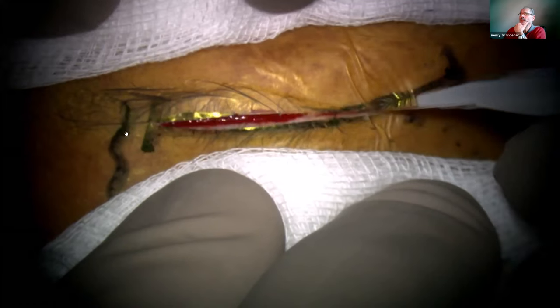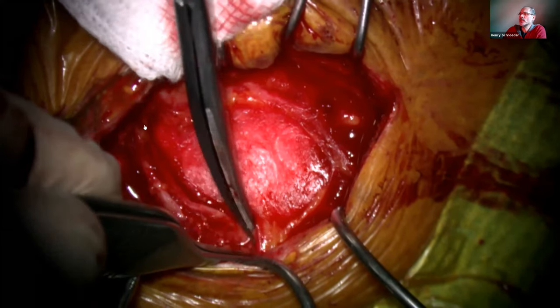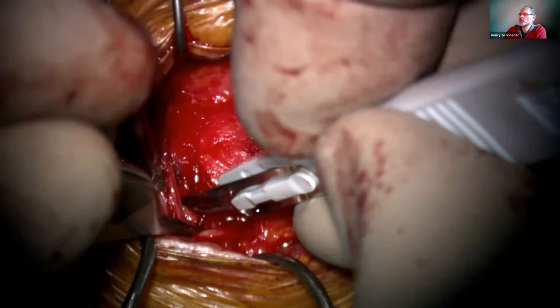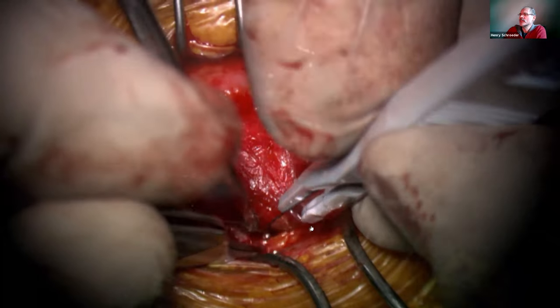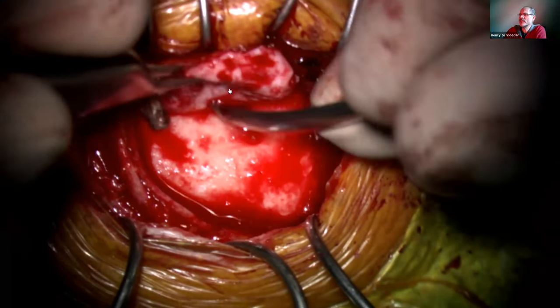So here is a video to show you how we do it. This is the marking of the supraorbital nerves. Then we make the incision of the skin. Sometimes you can identify the nerves and we mobilize them. Then we cut through the periosteum. We create a flap, which has a base to the skull base and it's retracted there.